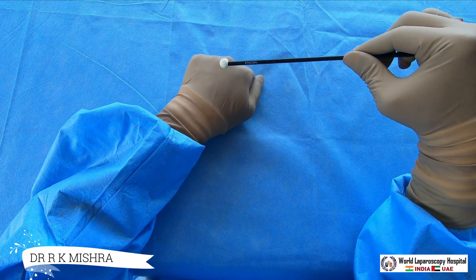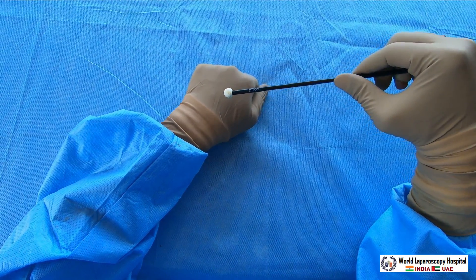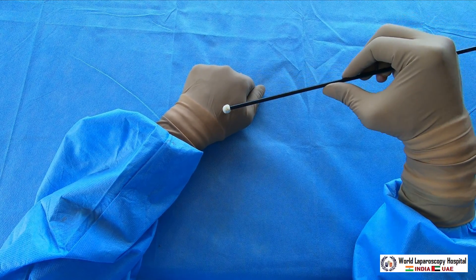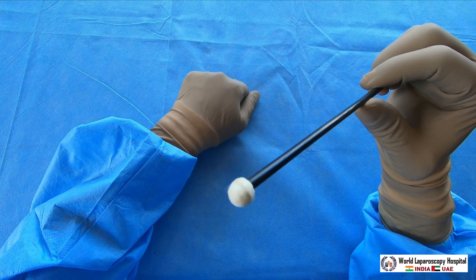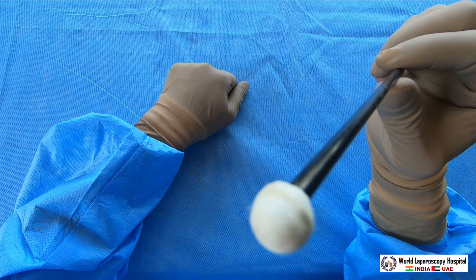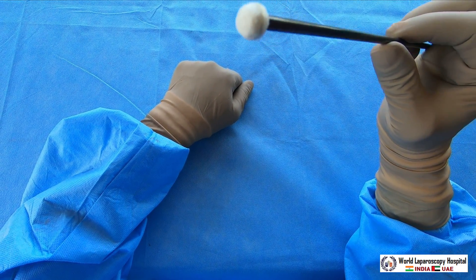It is very useful to do blunt dissection. Many times in hysterectomy we have to separate the bladder from the cervix, or in cholecystectomy you want to do blunt dissection of the gallbladder — at that time this peanut dissector is very useful. One drawback is that it is strictly disposable after one use.